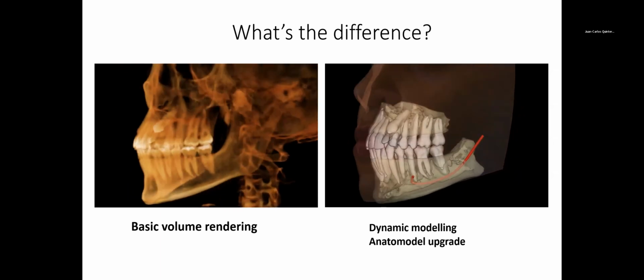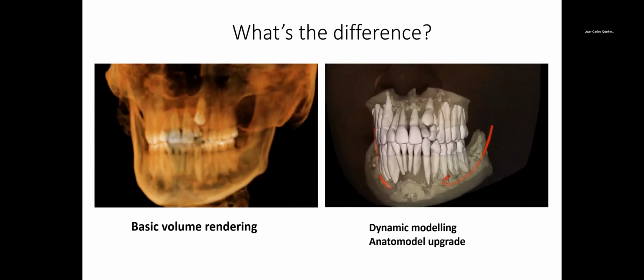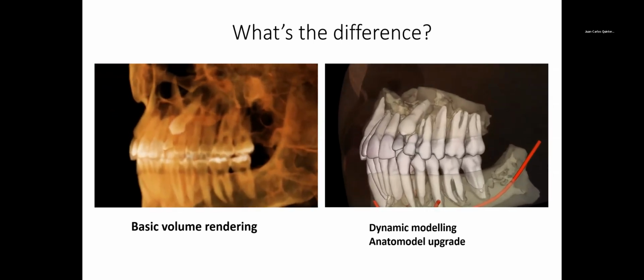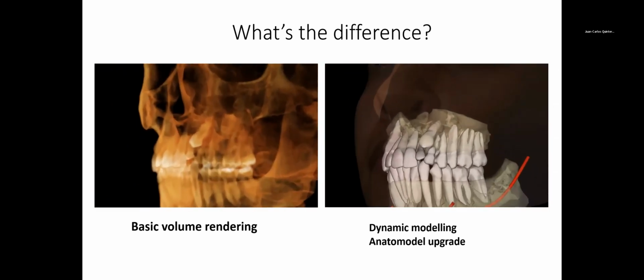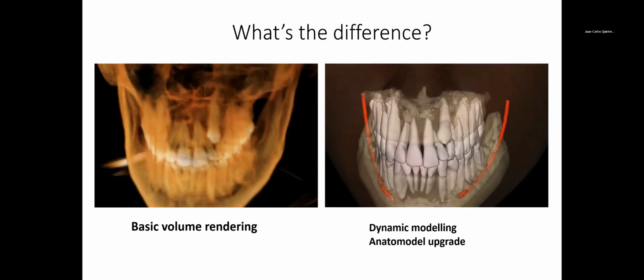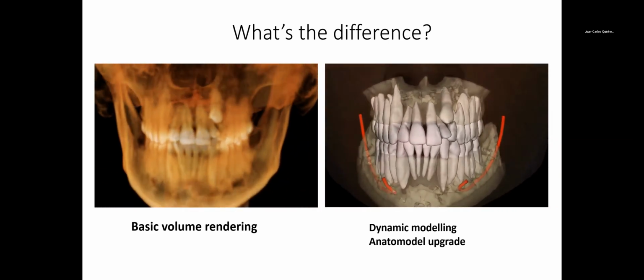Same thing, impacted canines. For those who are just getting started with this technology, impacted canines is probably the first reason people would want to do this, to really visualize and to be able to move. Now on a Panorex, you can imagine, is that impacted canine buccal or lingual, right? Yeah, there's the slob rule and all that kind of stuff. But keep in mind that could be higher radiation depending on the settings, right? So why would you not want to do this if it gives you better diagnostic information at a lower radiation cost? And if you could do an in vivo model with segmentation, it's kind of a no-brainer.